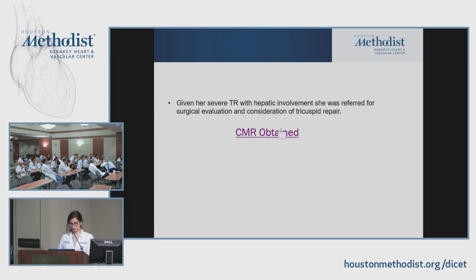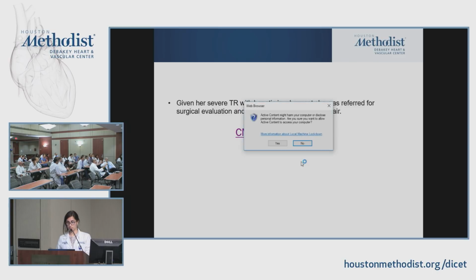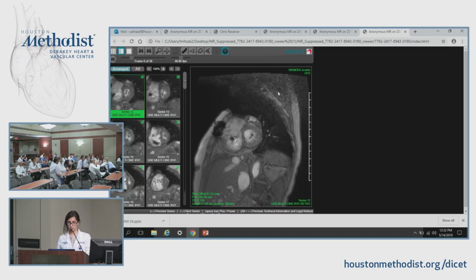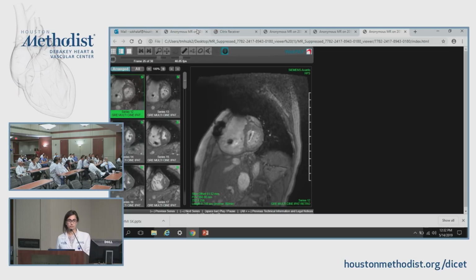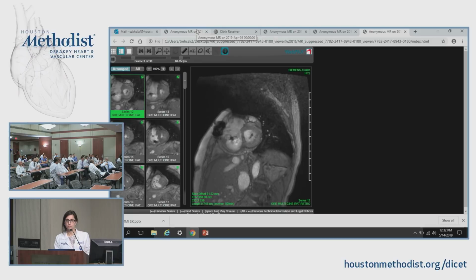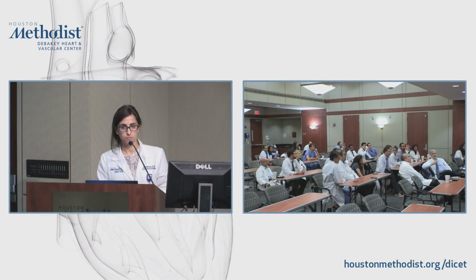What do you need to assess the severity of the mitral stenosis here? You see what I mean? You have a mean gradient of 7 at a normal heart rate because it's paced. Pressure half time is unreliable. You look at the VTI, which is in the 60s. So if the stroke volume is 60 coming through the ventricle, which is small, you have a valve area of 1. You have wide open tricuspid regurgitation. You have a pacemaker through the tricuspid valve. I don't know if that's contributing, yes or no. You have a hemodynamic situation on the left side, a low flow situation. So therefore, the mitral stenosis is severe. There's no question about it.